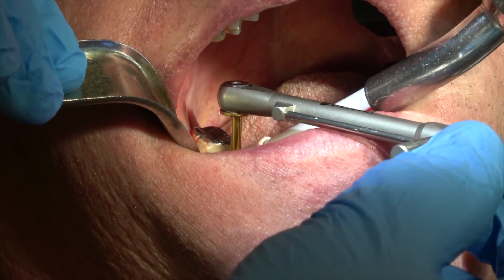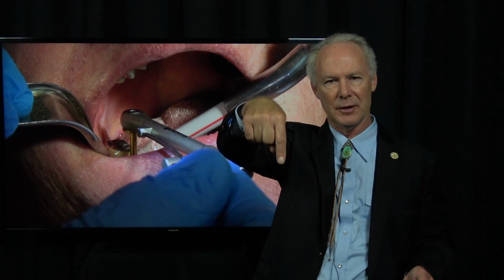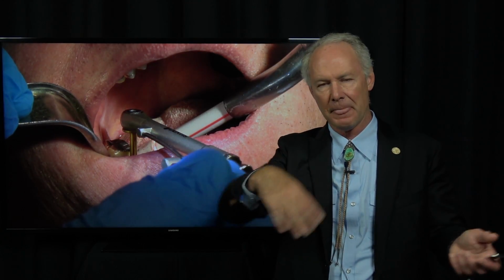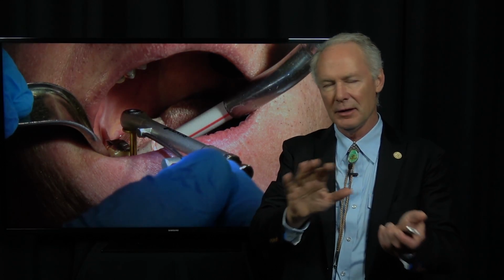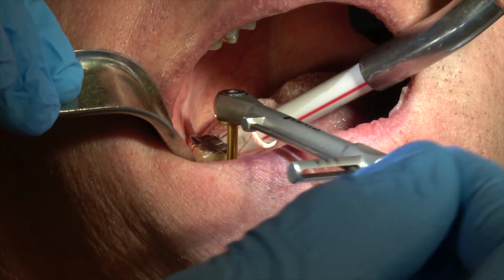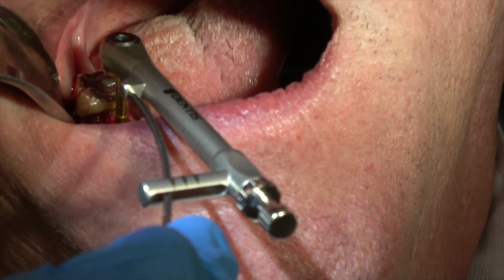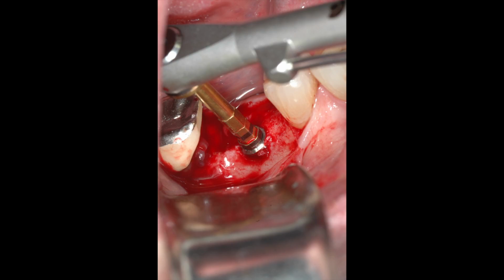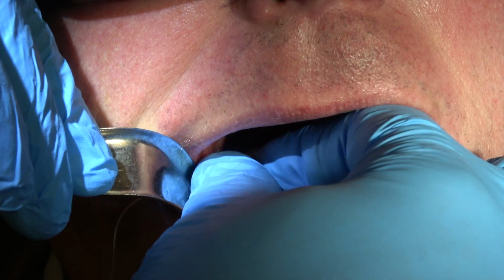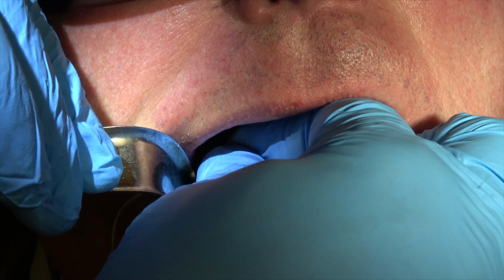The thing I love about this is so specific. If you're using those silver drills that don't have a shoulder, you may be a little bit off on your depth. With these, the depth is perfect. As you can see, I'm at 35 Newton centimeters of torque here, which is perfect at 12 millimeters. And here's the healing cap, and these are just bone level healing caps for 3 months.